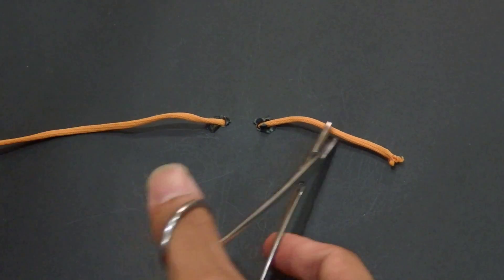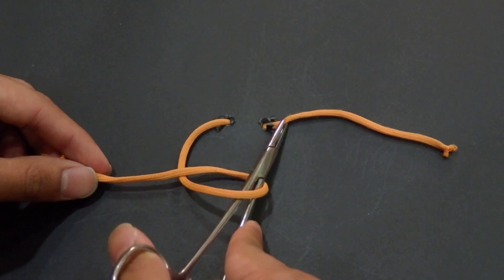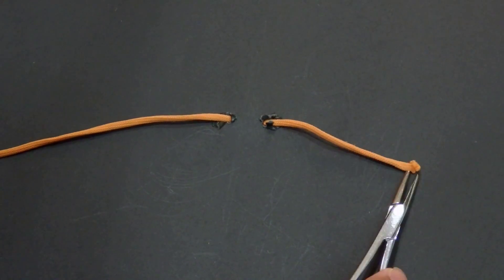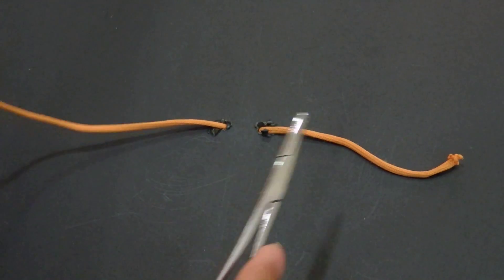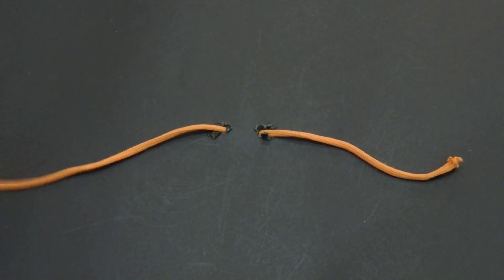These are the four common mistakes regarding tying by the needle holder. First mistake: making it too long. Second mistake: holding the base. Third mistake: bringing the free end toward only one direction. Fourth mistake: forgetting whether you started the first knot from inside or from outside. Thank you.